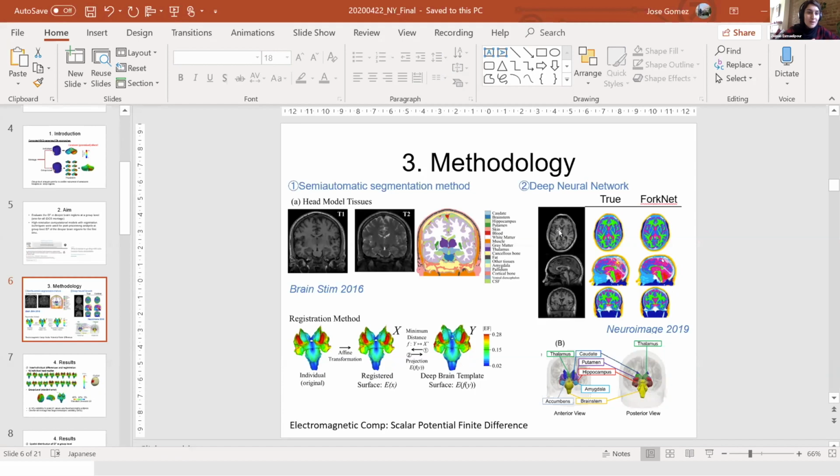Okay, another question. I don't know if you probably answered it at some point. I missed it. Is it sensitive to the conductivity that you assign to CSF? Yeah, this is a very interesting point. For the CSF, I think we are quite confident on the values. Maybe the variability for CSF is not so large as for the other brain tissues, like the gray matter, for example.